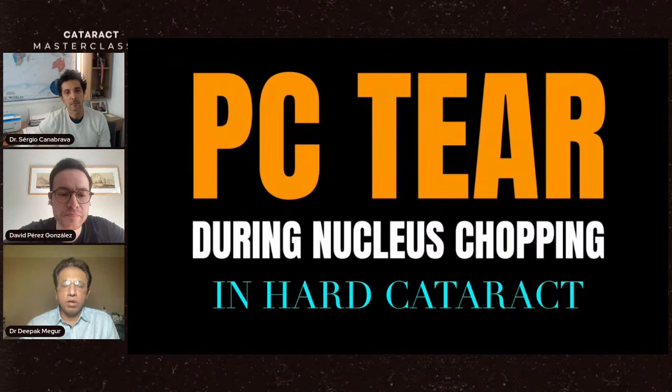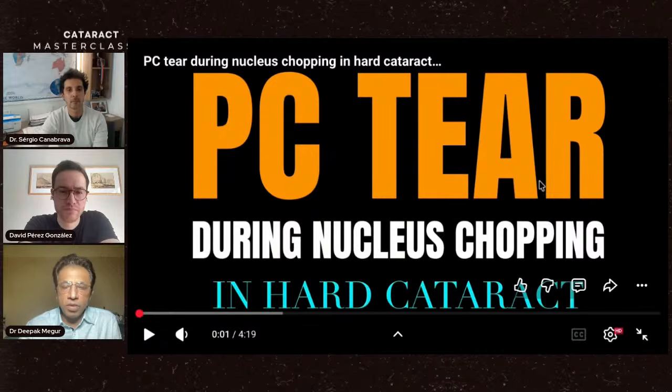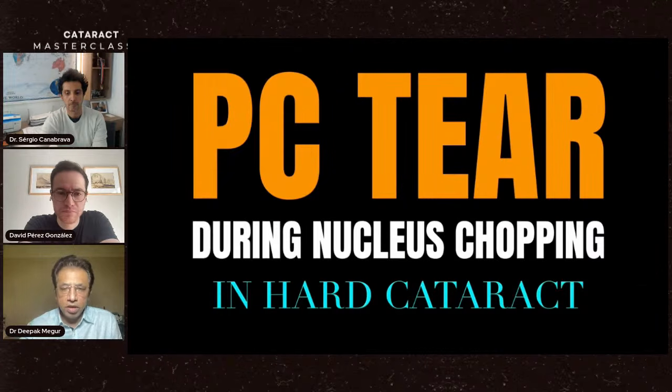There would be corneal burn, and a much bigger concern is that the incidence of PC tear is significantly higher when dealing with a dense nucleus, especially with beginner surgeons. So some of the common mistakes that beginner surgeons make and ignore are what I'd like to highlight.